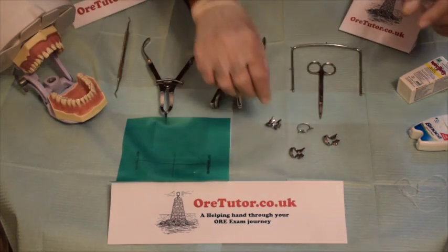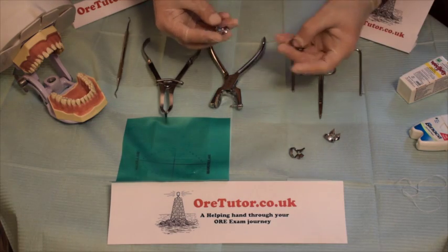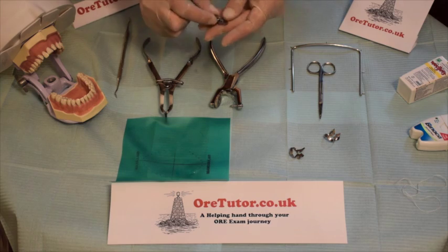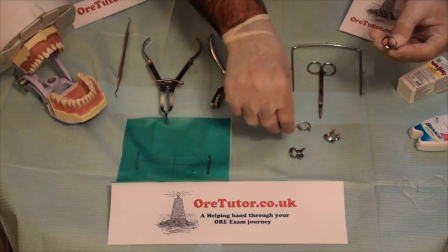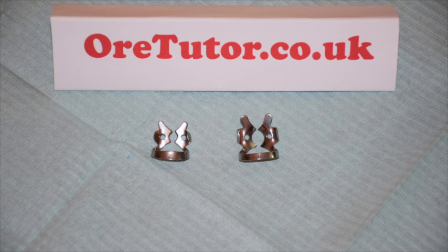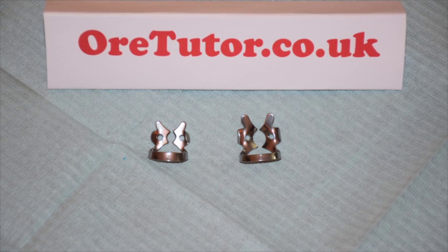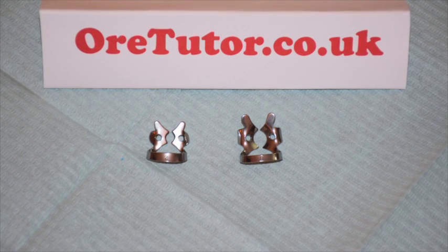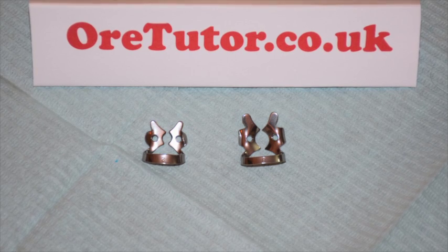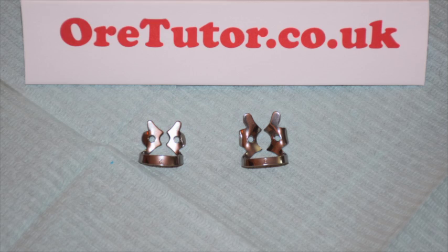Next, you want to choose your clamp. You have a lot of clamp types — winged and wingless. In this video I'll be showing you the wing technique. For a lower first premolar, you have to choose a clamp with a smaller hole. One clamp has a small hole and one has a bigger hole — the bigger hole is for molars, the smaller one is for premolars. So just choose the clamp with a smaller hole.